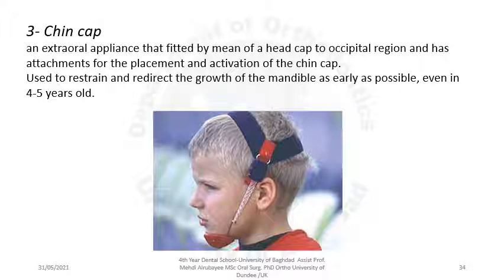Chin cup, an extraoral appliance that is fitted by means of a head cap to the occipital region and has attachments for the placement and activation of the chin cup, usually to restrain and redirect the growth of the mandible as early as possible, even at 4 to 5 years old.